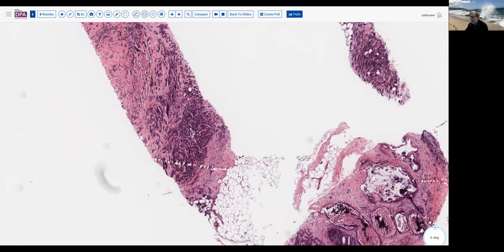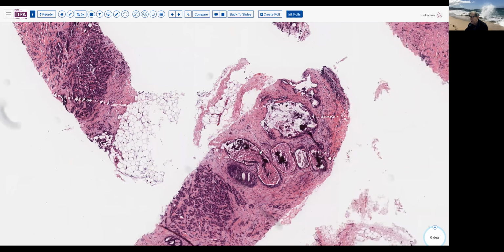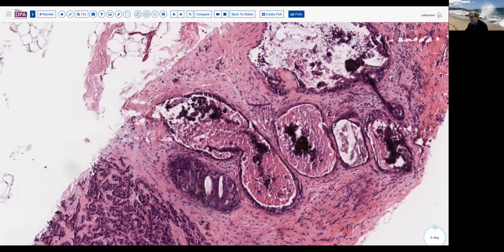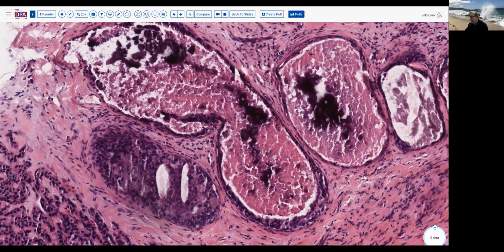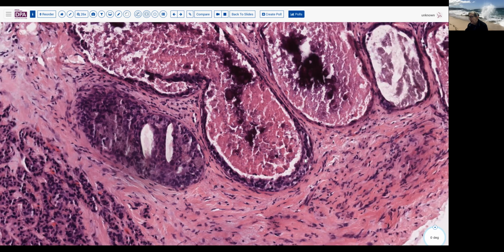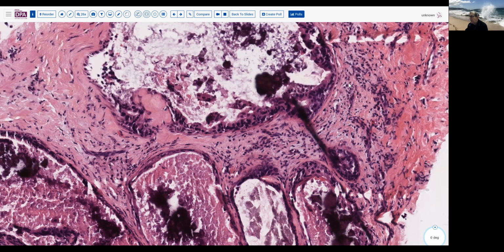Notice here that in this case, we have associated in situ tumor with necrosis and probably some calcification here. Here you see some cholesterol clefts in an adjacent duct. And there's not much remaining ductal carcinoma in situ around here. But this is not an ultra high grade, nuclear grade 3 type of DCIS.